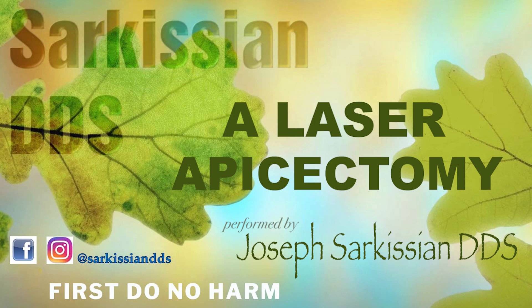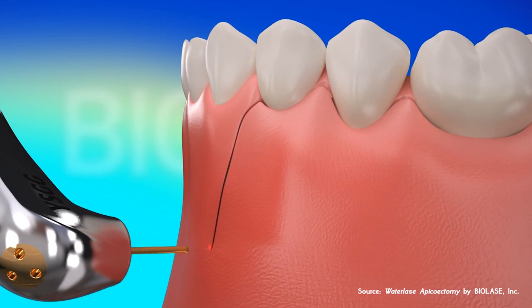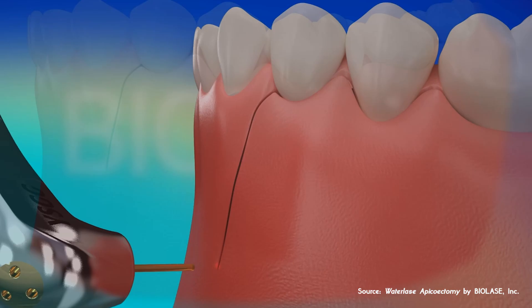Hi, this is Dr. Sarkissian. In this video, I will be showcasing a laser apicectomy — basically the cutting off of the tip of an infected root canal tooth.